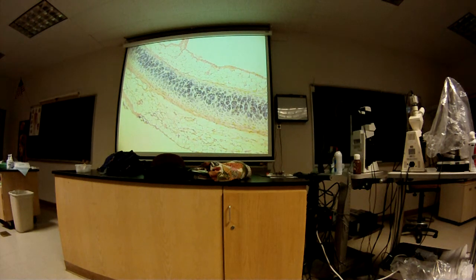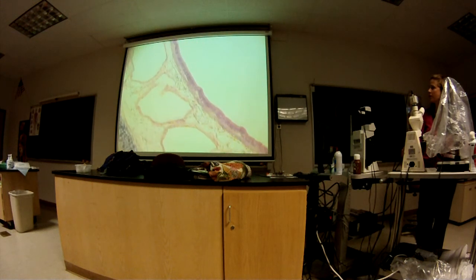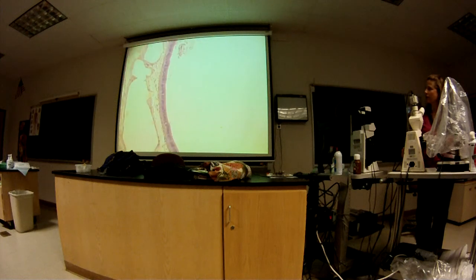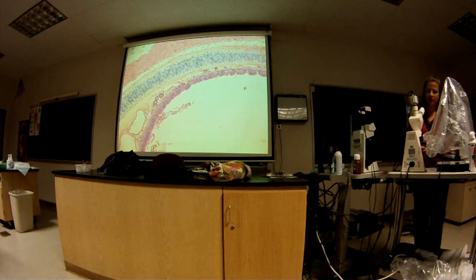Okay, and then the epithelium. What kind of epithelium? Even though you can't see it right here, can you? It's a little funky right there. Yeah, simple? Crazy submucosa right there. Okay, so yeah, the respiratory system, pseudostratified, ciliated, columnar, almost the whole thing. So all the upper respiratory system is that pseudostratified, ciliated, columnar. Now until you get down to the smallest portions, the bronchioles and the alveoli, does it change?